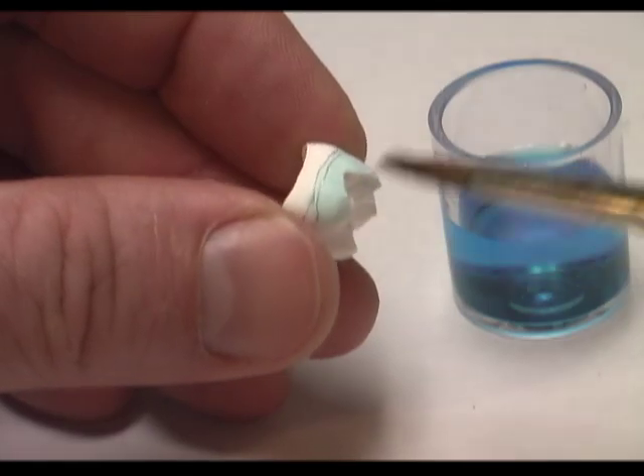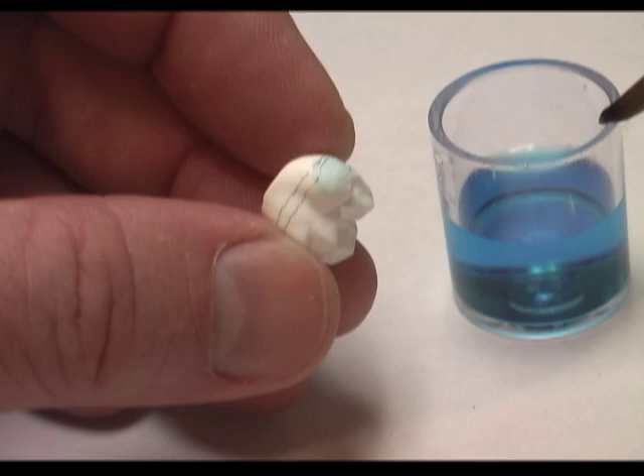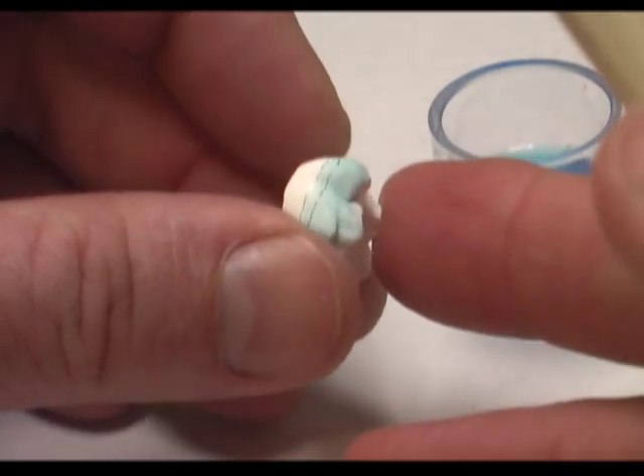So by starting with a lighter color first, we're saturating some of the zirconia so that by the time we start with our dentin materials, less of the dentin color will penetrate up towards the incisal.